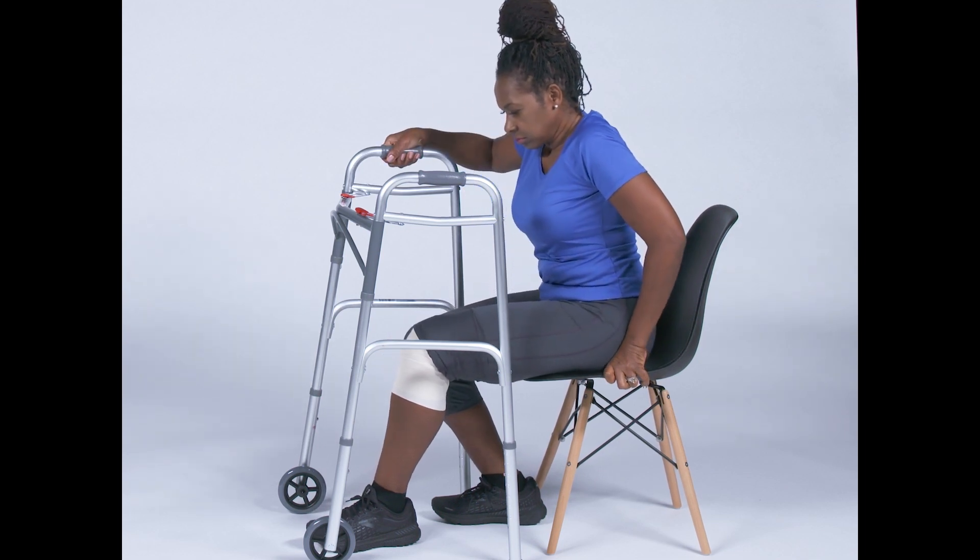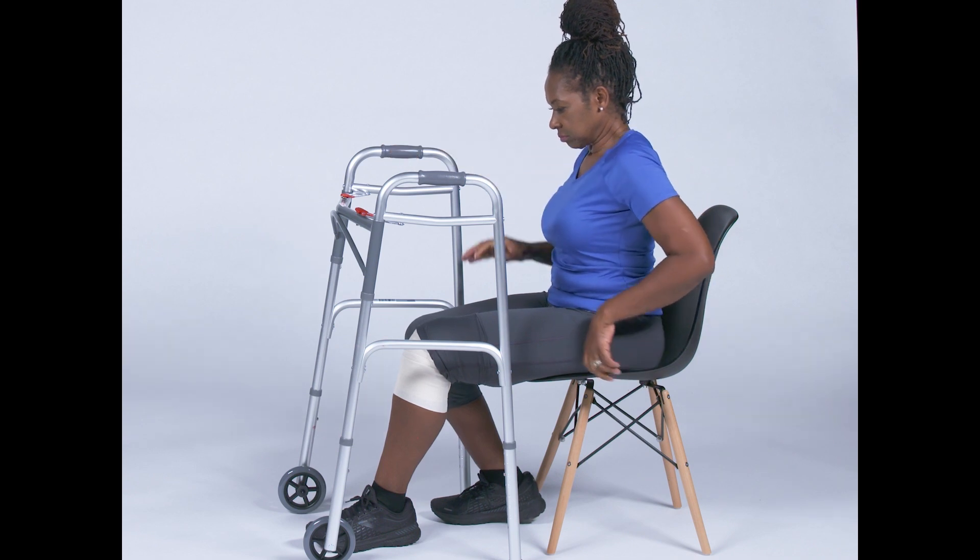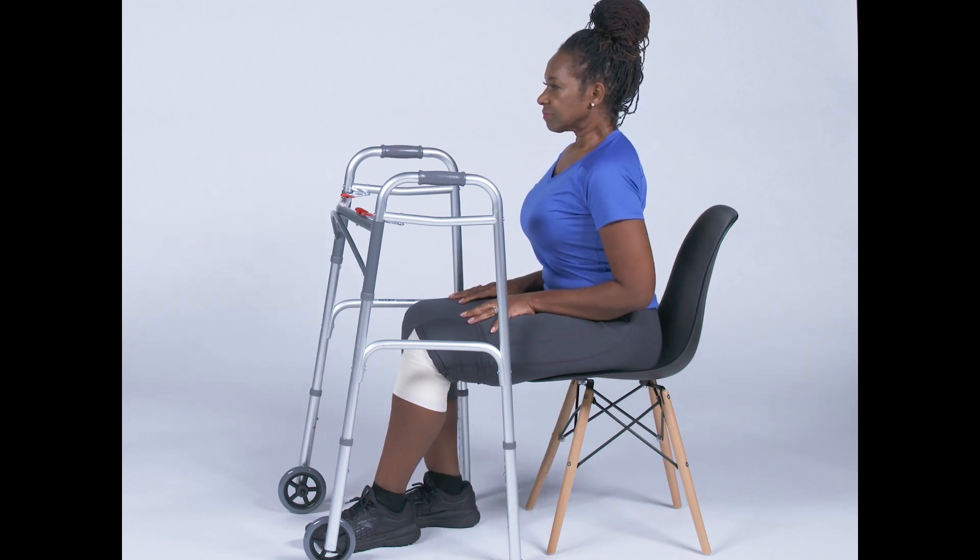If possible, it's a good idea to practice these movements with another individual to ensure maximum safety. That individual can stand in front of you and hold on to the front of the walker while you practice standing and sitting.